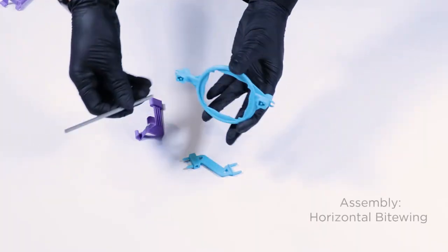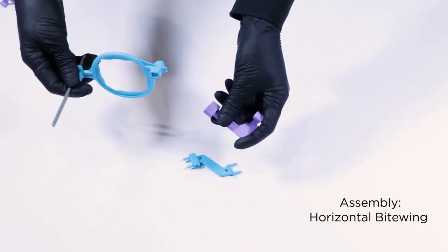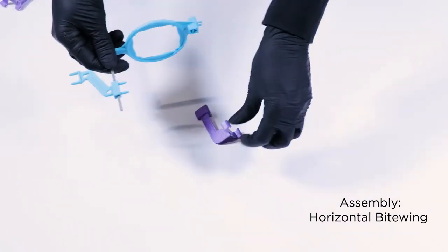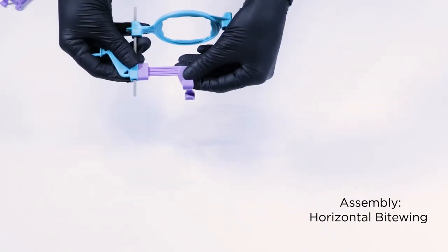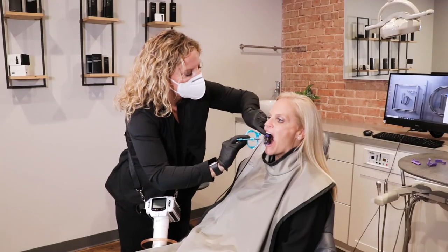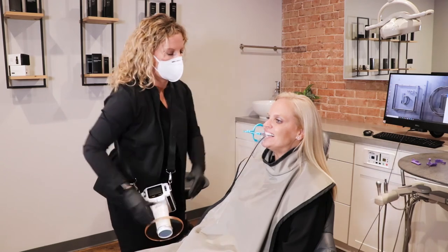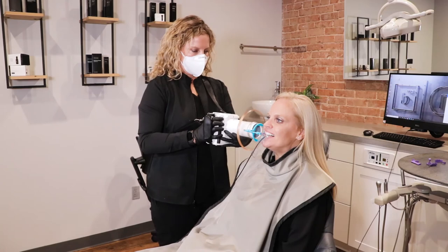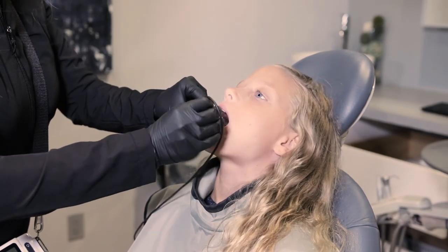For horizontal bite-wing x-rays, place the sensor between the tongue and the teeth. Align the front edge of the sensor towards the midline to follow the curve of the mouth and help with getting open contacts on your image. Have the patient bite down. Press the ring as close to the face as possible. Line up the x-ray with the ring and expose your x-ray. Here's an example of what it looks like when a bite tab is used on a pedo patient.